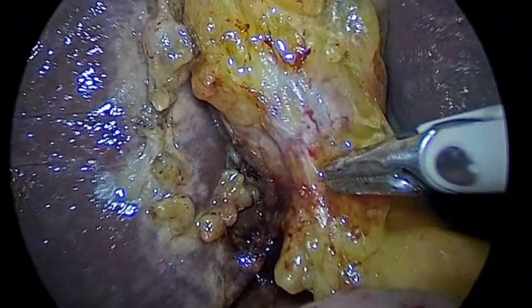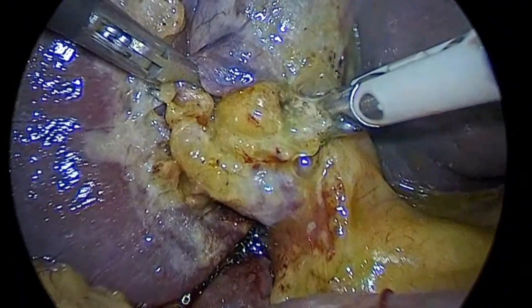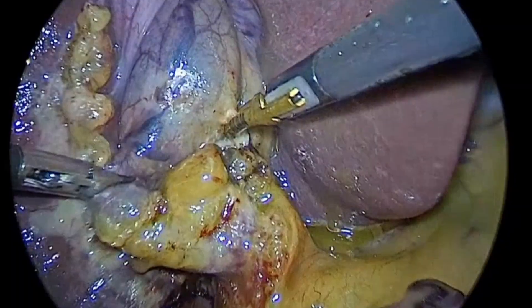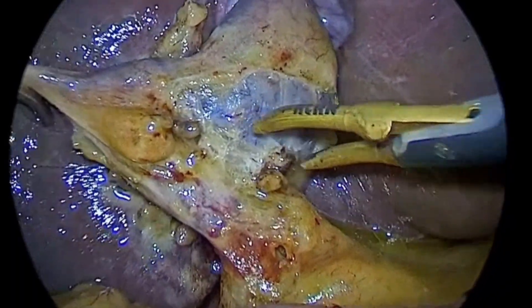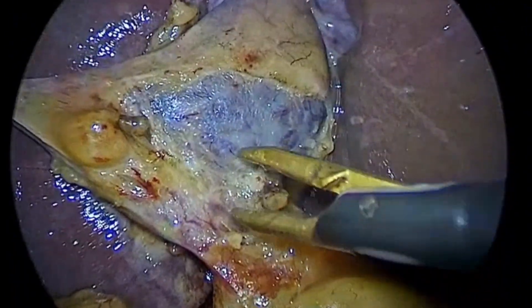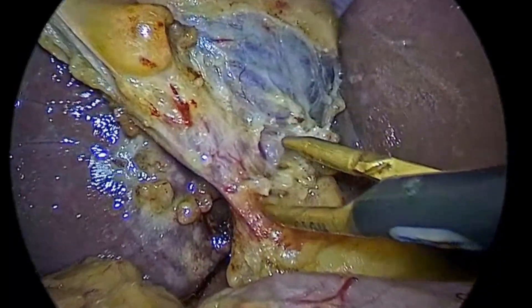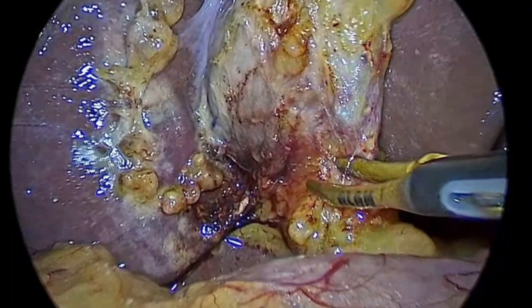This is almost certainly the cystic duct. There is some reservation about this technique I am using because it is not following the critical view of safety — CVS. This is the cystic artery branch on the gallbladder wall which has been divided. I am dissecting in a way that this vessel along with the lymph nodes are going up, and this is the cystic duct — just a little clearance of the fibrofatty tissues on the posterior aspect also.